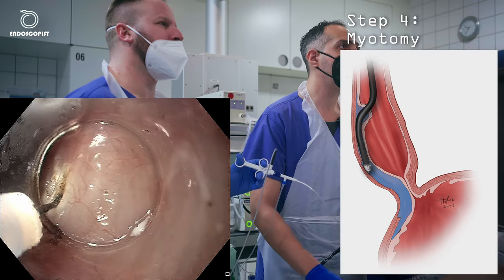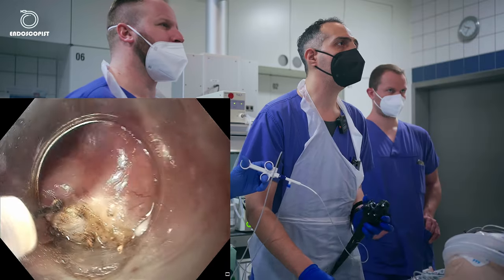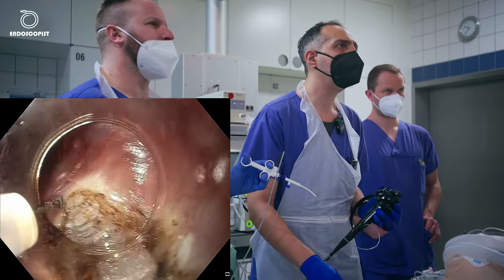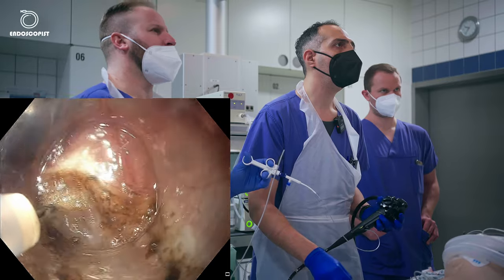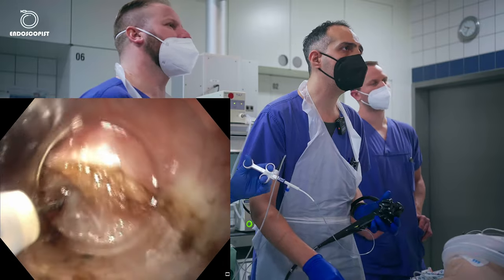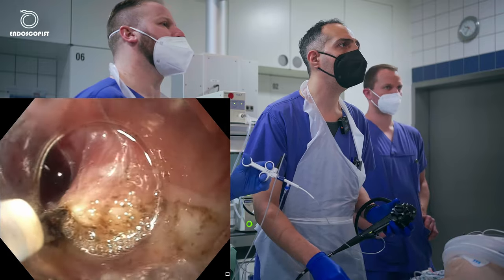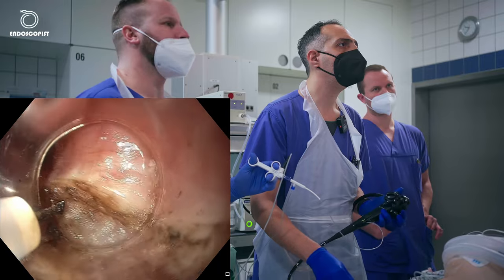So I'm cautious at the first cuts in the muscle layer. We'll try to cut the circular muscle and keep the longitudinal muscle layer intact. So here we finished it. Very cautiously, very slowly. Here we see the longitudinal muscle fibers below. So I will hook at these muscle fibers and I will go with the scope minimally, very gently upwards and we'll cut. Look, here we cut.